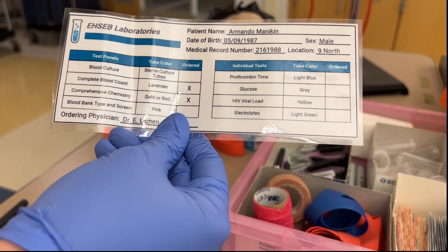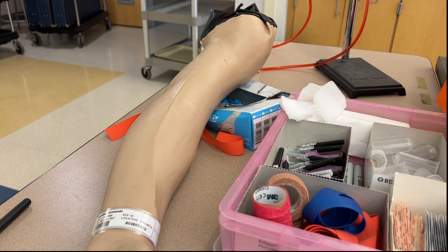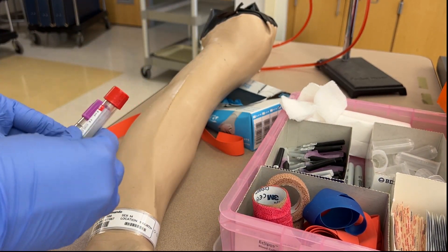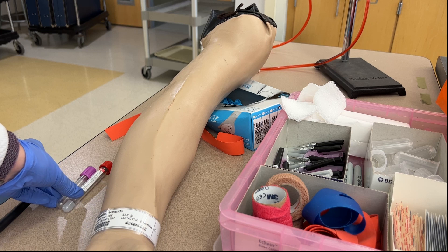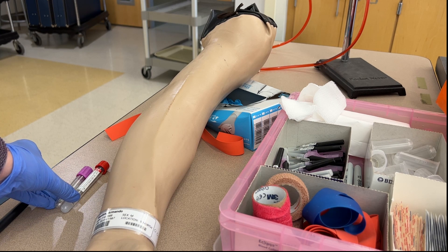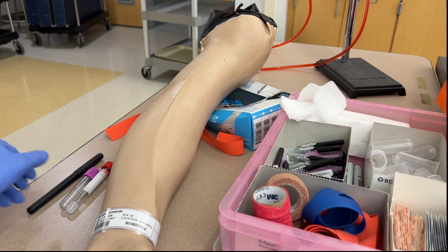Now that we've properly identified the patient we can grab the correct tubes needed for the test order. This patient needs a red top tube and a purple top tube. I like to set them on my non-dominant side so that I can easily reach them during the venipuncture in the order that I'll need them. All your materials should be put on the side of your non-dominant hand so that you do not have to cross over your body during the draw.